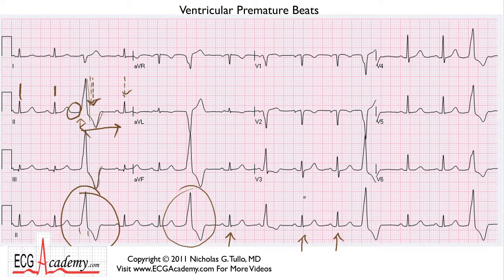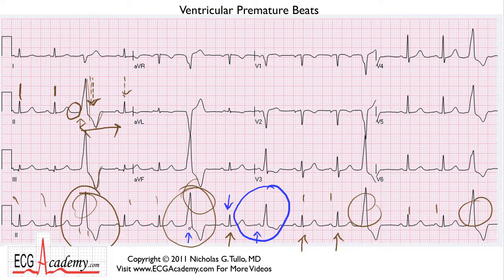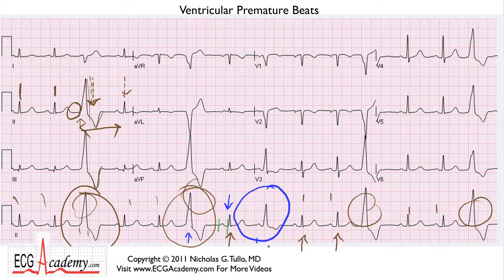There's a trigeminal pattern here: normal, normal, premature — repeating. But one beat is particularly interesting. It has a P wave in front of it and the QRS looks wide — not as wide as the PVCs, but not as narrow as the underlying beat. It looks halfway between the PVC and the normal beat, and there is a P wave in front of it. Looking at the PR interval is really important here: the underlying PR is about 180 milliseconds, but this PR is significantly shorter — only about 120 to 150 milliseconds.